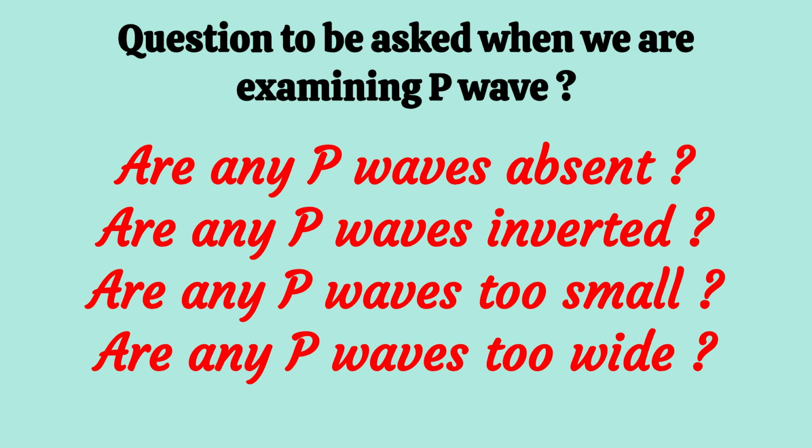Questions to be asked when we are examining the P wave. Are any P waves absent? Are any P waves inverted? Are any P waves too small? Are any P waves too wide?